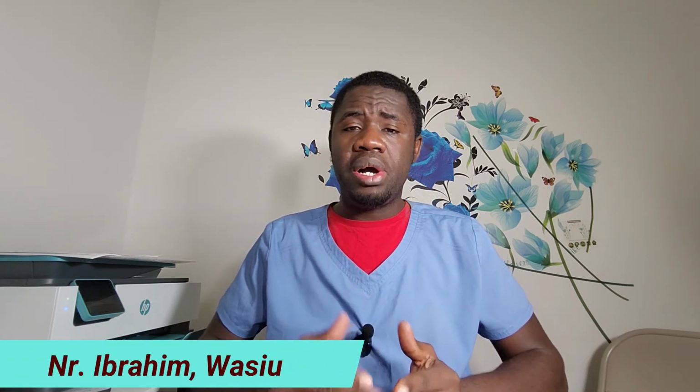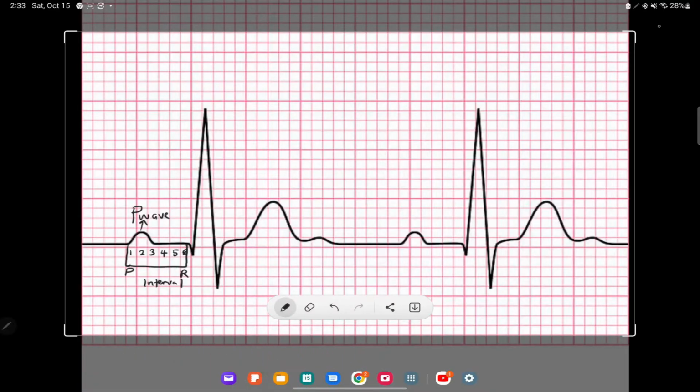So now we multiply the number of boxes that the PR interval occupies. 0.04 second times 6 boxes translates to 0.24 second.